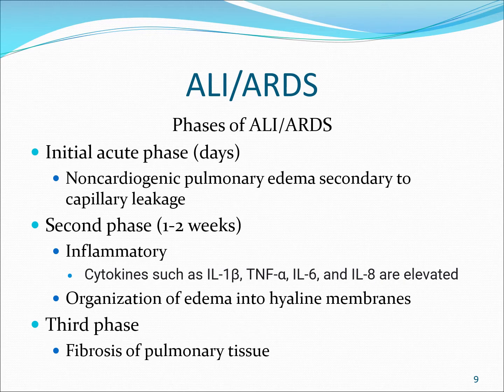So the whole point of me educating you on ARDS now is that you understand how to utilize APRV at this point. And if you do, you actually decrease the mortality of the patient. The patient has a better likelihood of surviving if you jump on it. When do you want to jump on it? As early as possible and no later than the second phase. When you start seeing these things happen, you want to intubate the patient, you want to manage them with a low tidal volume, high PEEP strategy, or you want to use APRV right from the get-go.